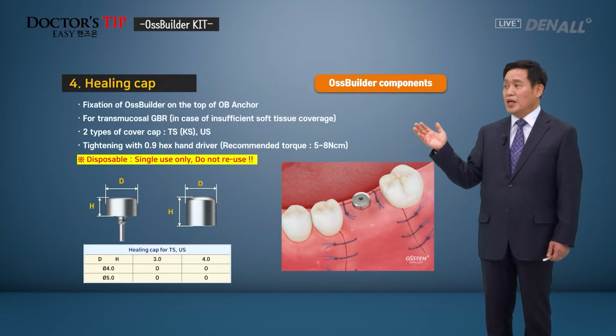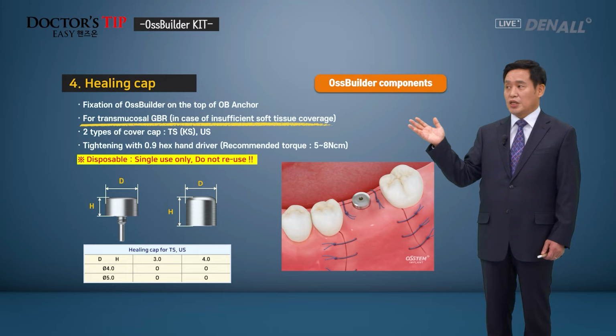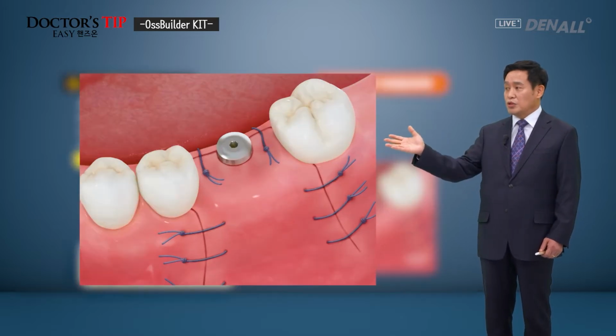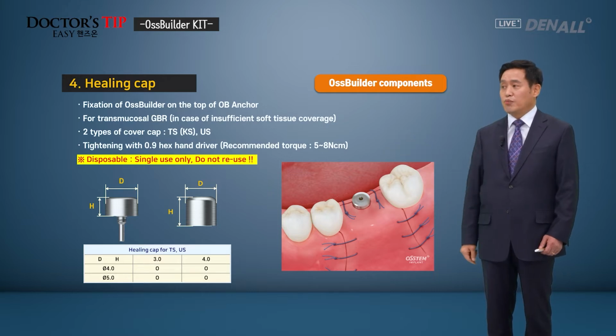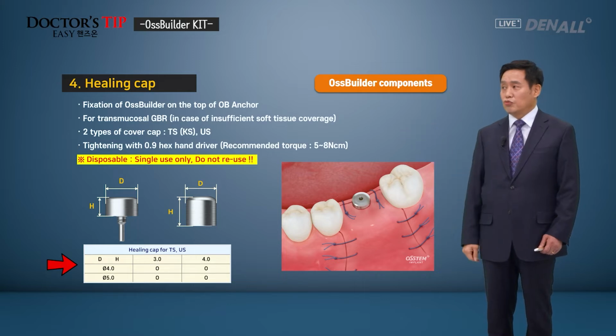Next is healing cap. Unlike the cover cap for OB anchor, when there is lack of soft tissue coverage, the so-called transmucosal GBR, on the top, like healing abutment, there can be exposure. When there's lack of soft tissue, you can use this method. When you do transmucosal GBR, you can use healing cap like this. And TS and KS, they're compatible to each other, and there's also one for US type. The diameter is 4.0 and 5.0, and the height is 3.0 and 4.0.